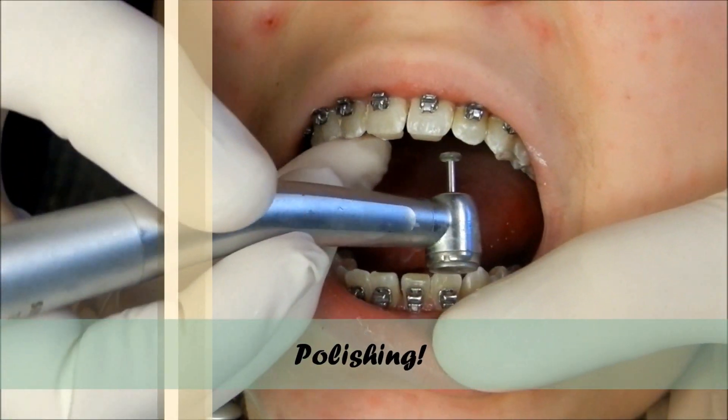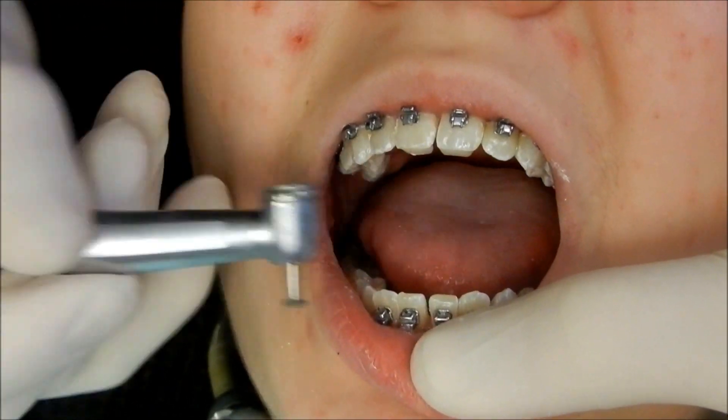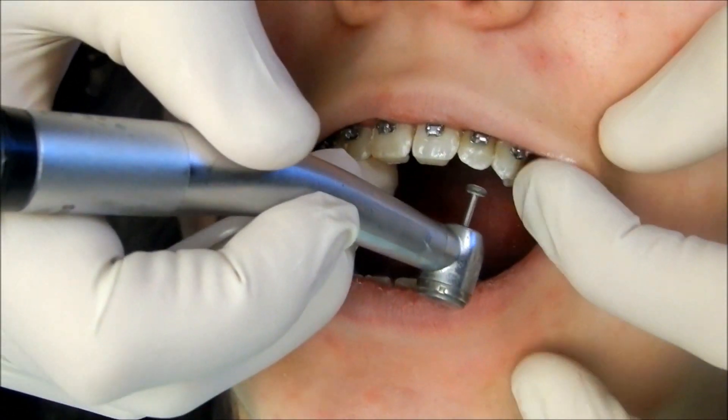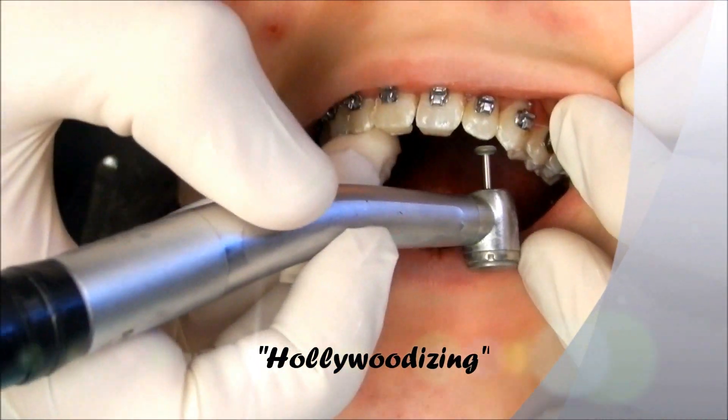Open a little bit. See these little bumps here? They're called mammalons — right here, little ones right here and here. So what I'm going to do is just polish these bumps off the teeth. It'll help them look better — we call it Hollywoodizing your teeth.